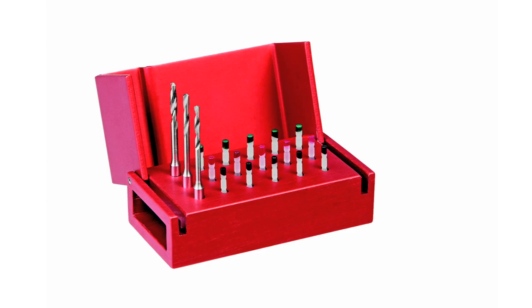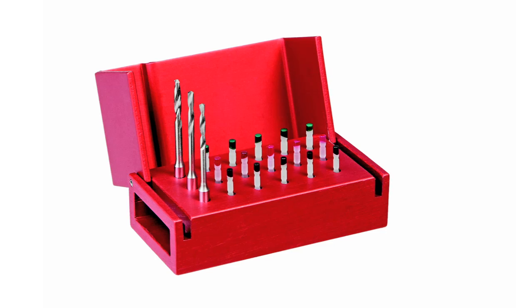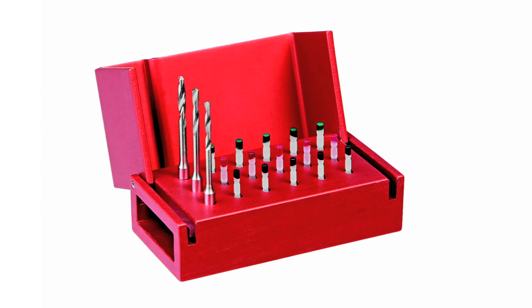The end result is a post that safely retains the core buildup while preserving the integrity of the remaining tooth structure.